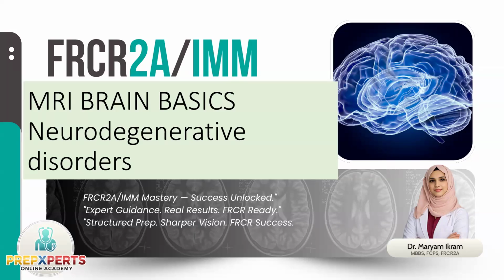Whatever region I start, I will always go through the basics of that system first, and then we will dive into the important high-yield topics. So from our MRI brain basics, inshallah, you will be able to cover some questions.